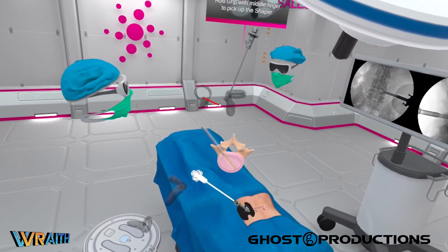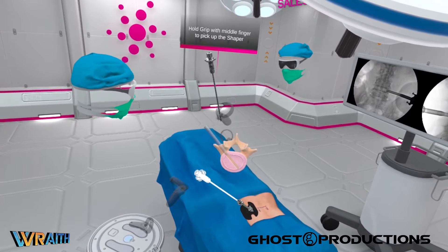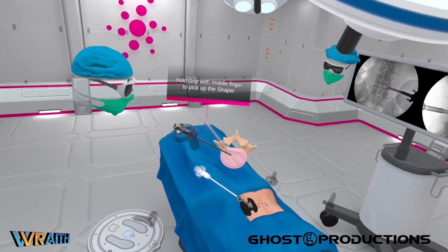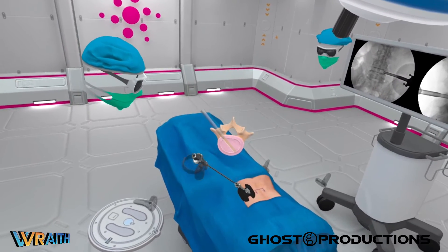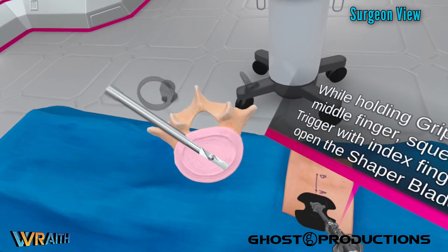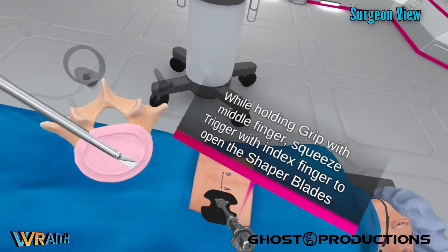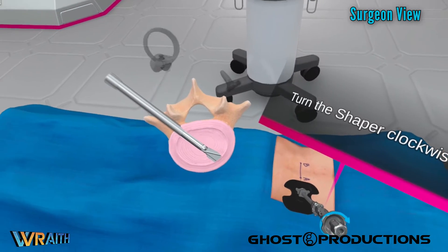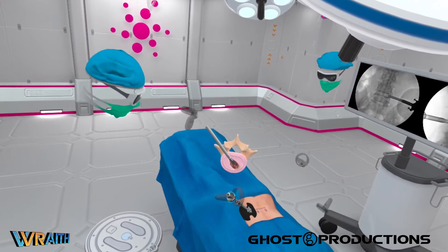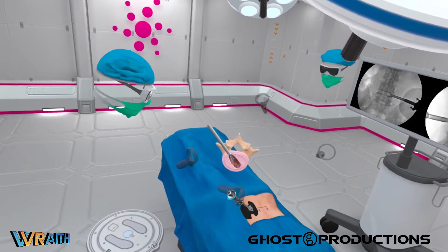The positive stop kept it from going into the annulus. This is a shaper — a shaper tool, a custom tool for this procedure. The point of this tool is to be able to expand the blades in the disc space to debulk some of the nucleus material and other disc material while making some decortication of the end plate to get bloody bone for implantation.